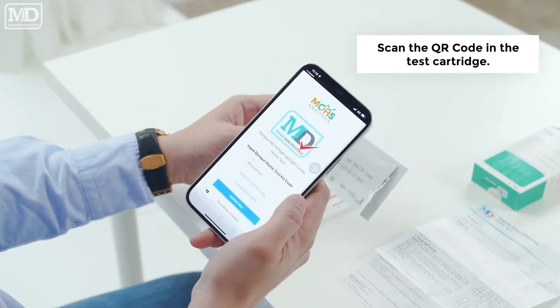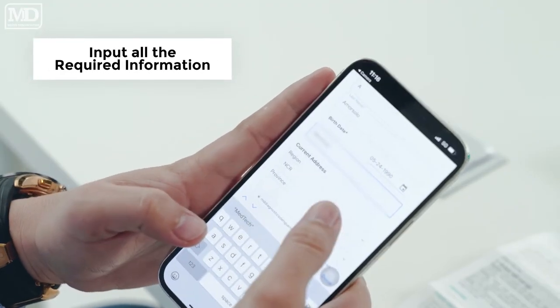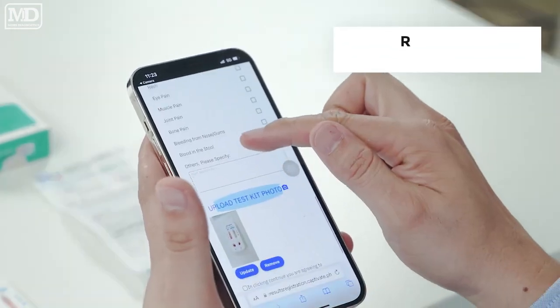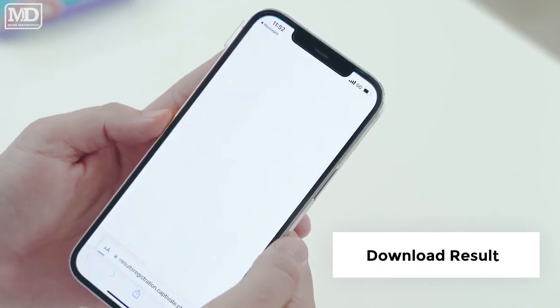Click Validate Now. Input all the required information and upload a photo of the results. Read the results and accept the terms and conditions. Download the results.